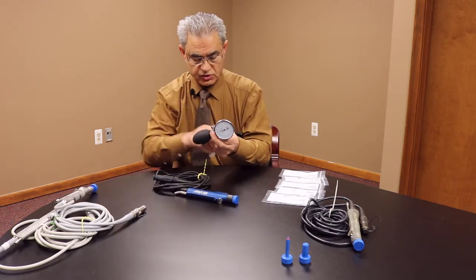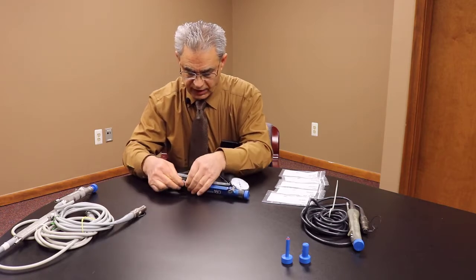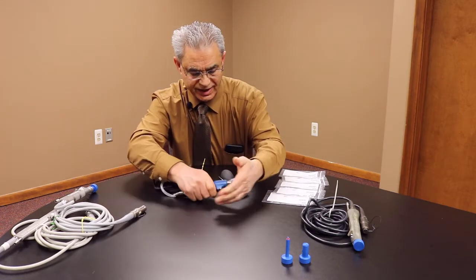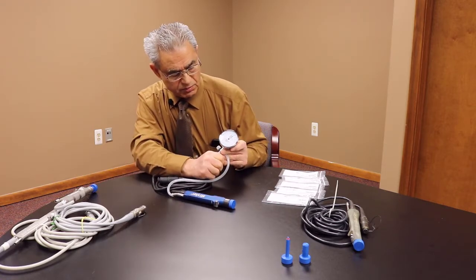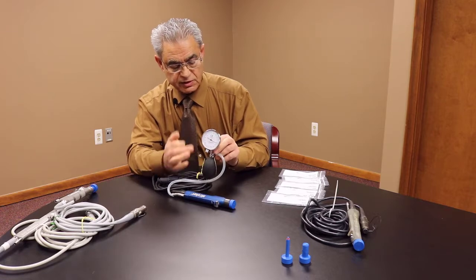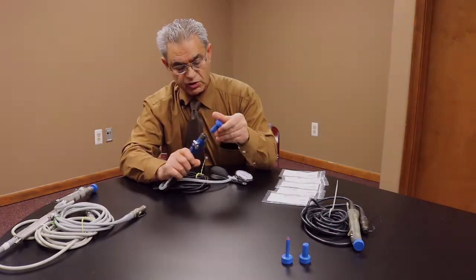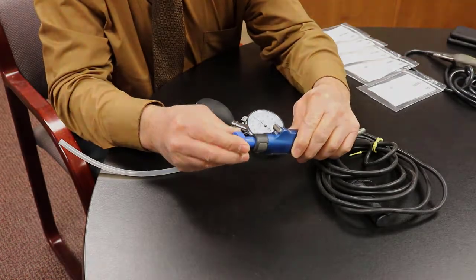So we're going to try another one — this is a Striker. Same approach: you attach the hose to it. This one has a latch, so you need to make sure it goes in correctly. You pump, and as you see there's no leakage. Some of these shavers have a little latch that you need to make sure you line up correctly before inserting.